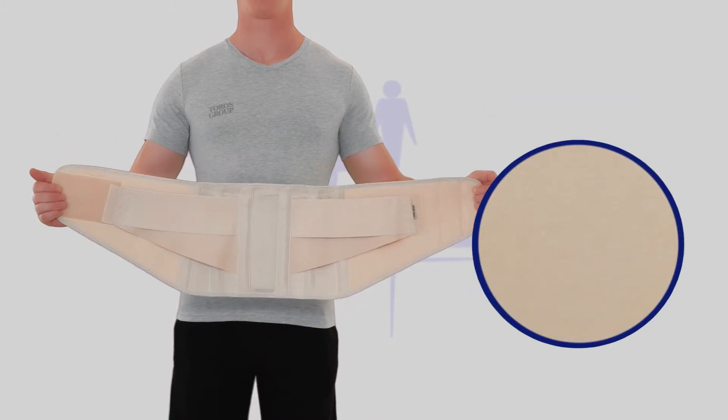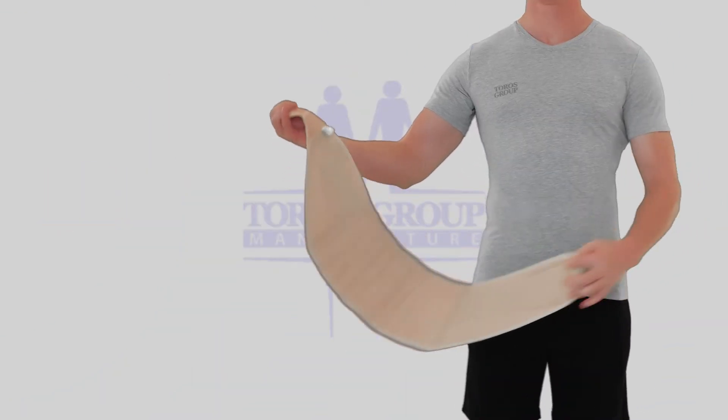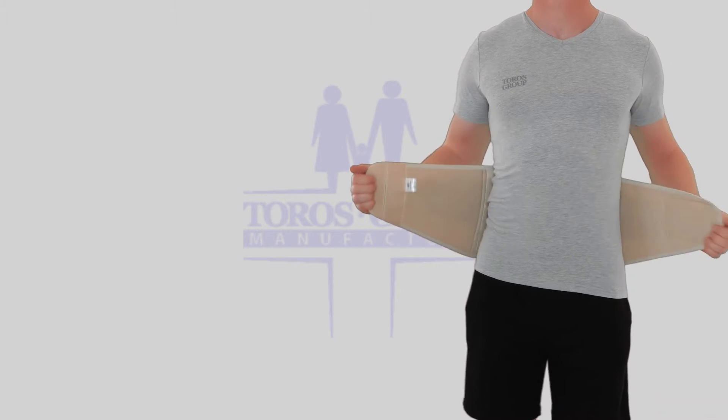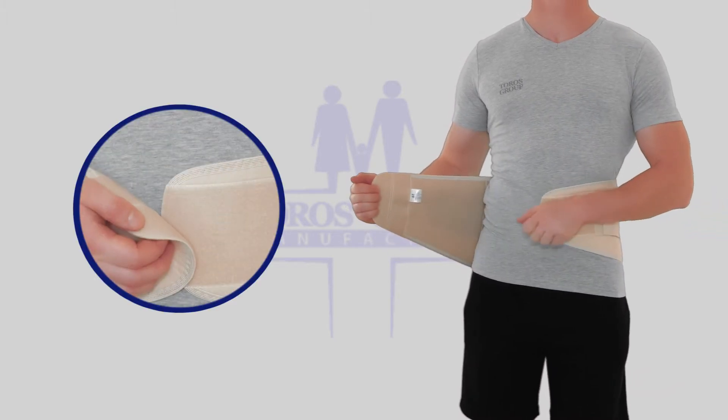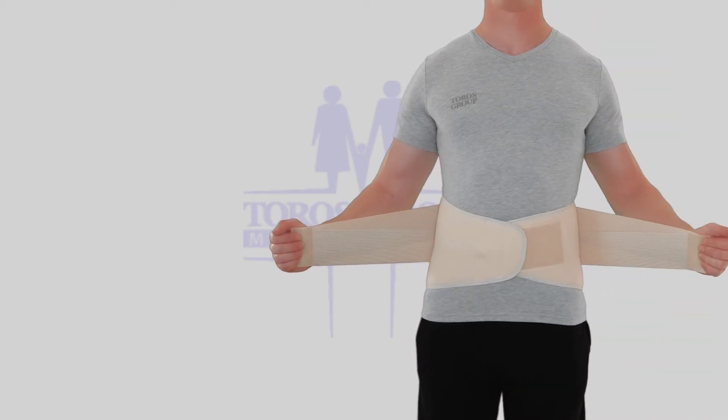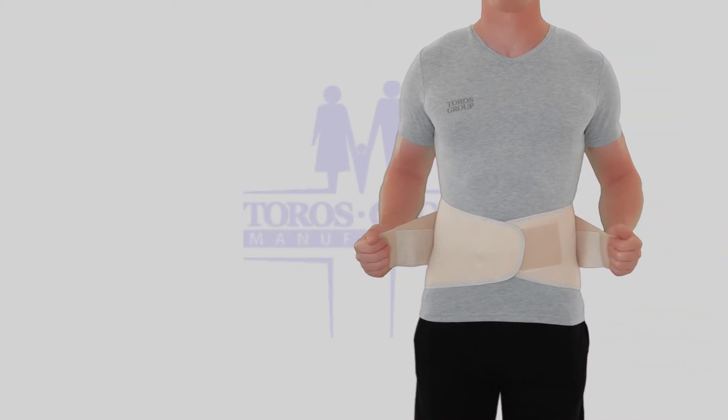Easy to put on — just wrap the brace around the waist and stick it on the front with the help of velcro. Velcro fasteners allow you to adjust the brace to any shape. Additional double-pull elastic straps are made for better spreading of lumbar spine load.